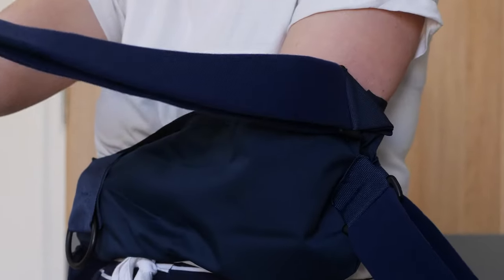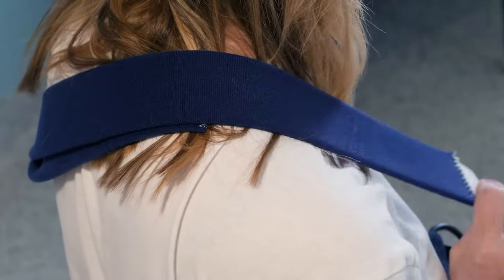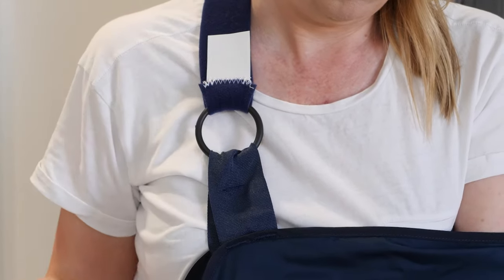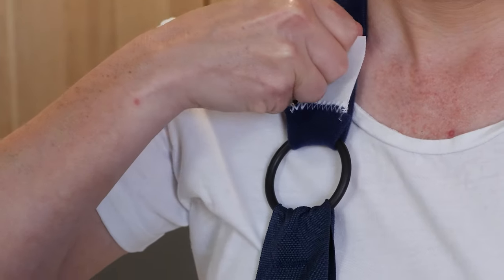Take the shoulder strap over your back, over the back of your neck and over your good shoulder, and insert into the top ring of the arm support, securing it with the velcro tab. The strap should be comfortably firm to provide support. You can adjust the tension by adjusting the strap at either end.